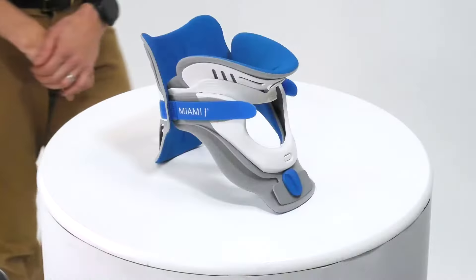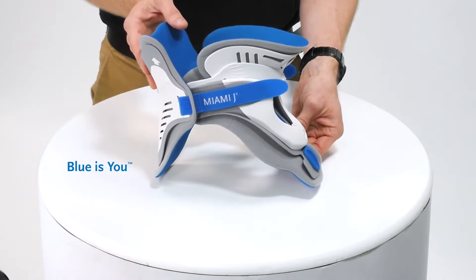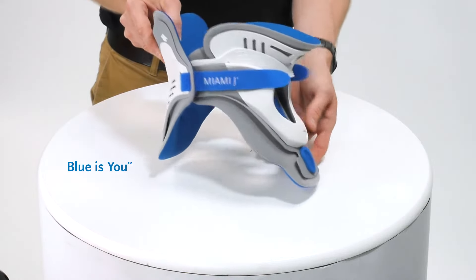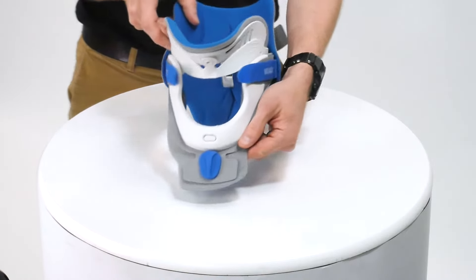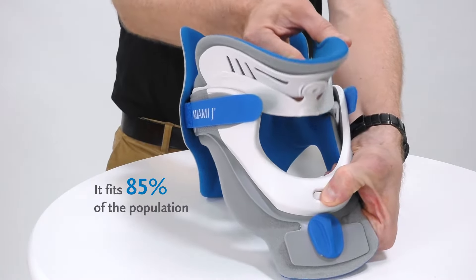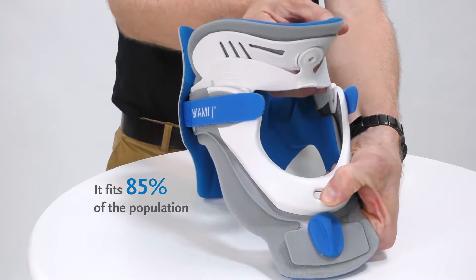So let's have a look at the collar itself. It has the blue-is-you functionality, so everything the patient interacts with has the same blue colouring. As we look from the front, there is a push button system that allows you to adjust the height of the collar according to the patient's size.